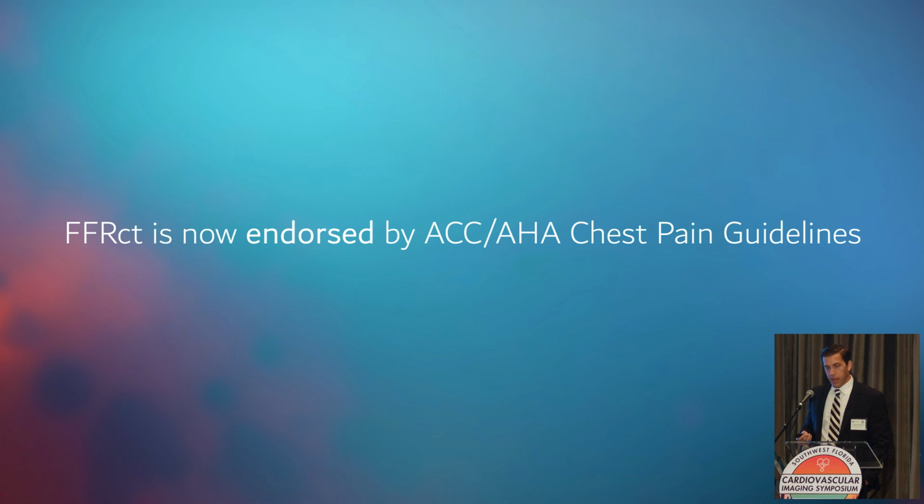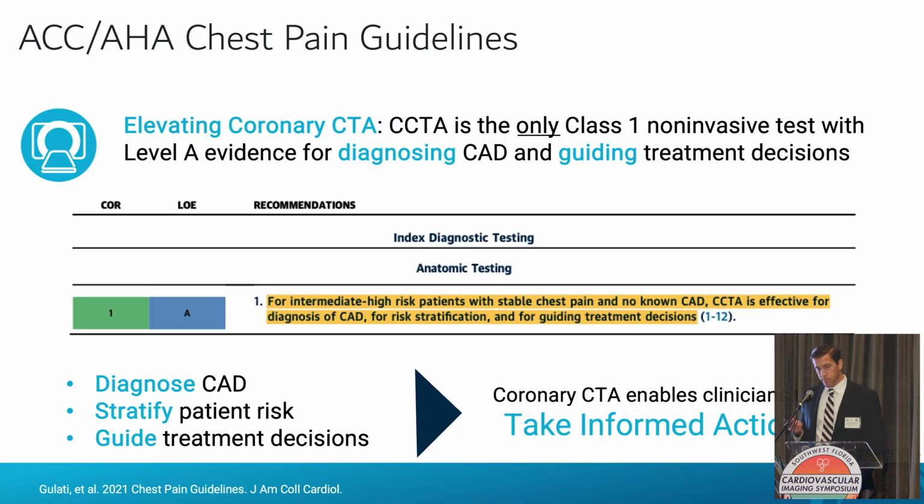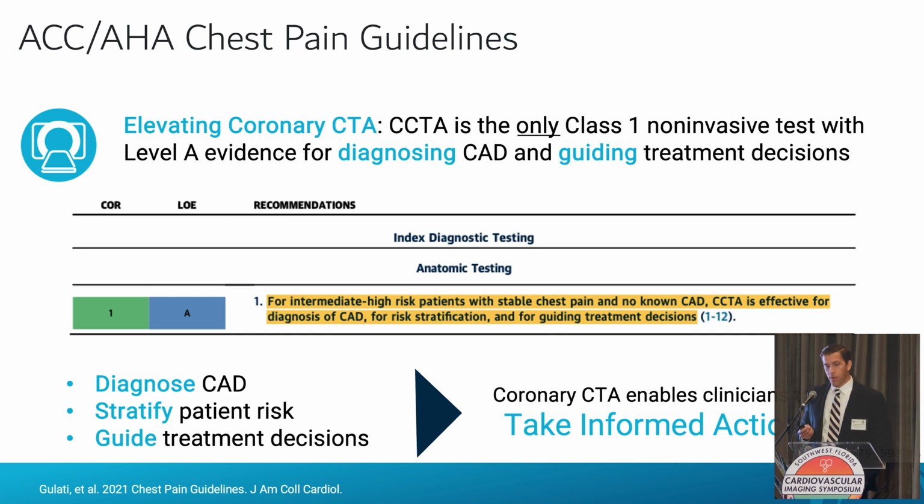We mentioned earlier that FFR CT is now endorsed by the updated ACC AHA chest pain guidelines. These were updated in 2021, multi-society guidelines, which give a real strong endorsement for coronary CTA and FFR CT. Dr. Budoff mentioned earlier, coronary CTA was the only non-invasive study that received a level 1 recommendation with level of evidence A for both acute chest pain and stable chest pain. So the only study to receive that 1A endorsement.